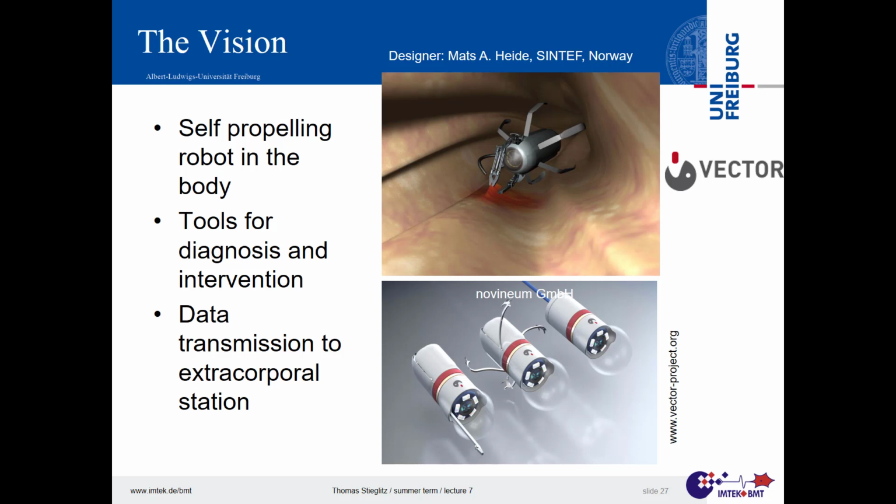And the idea is that you can have a better front lens to see even more than 140 degrees. These are again LEDs. Can't we have some devices that anchor if we want to stay there and see probably some time transition of certain inflammations or something like that? Well, that was probably we start with a cable at the end. And the other is, can't we integrate some tools?